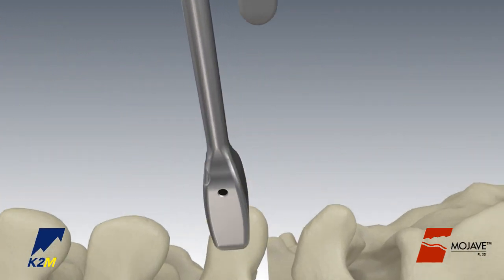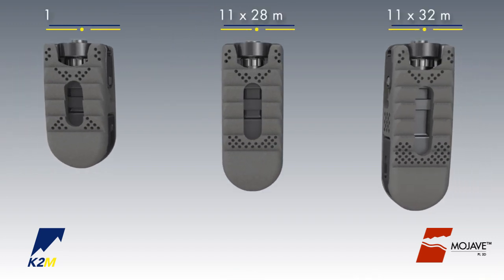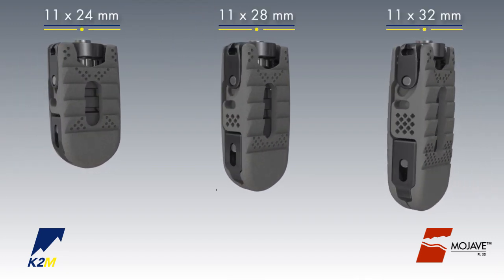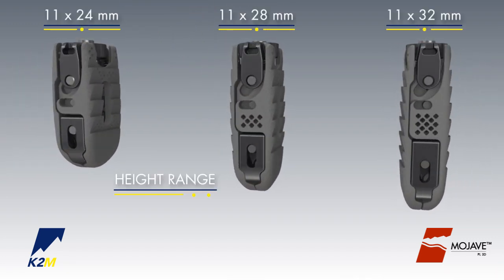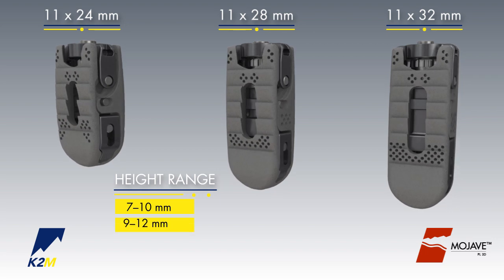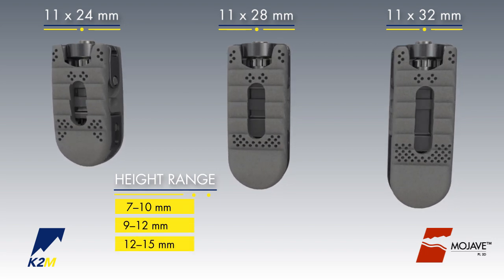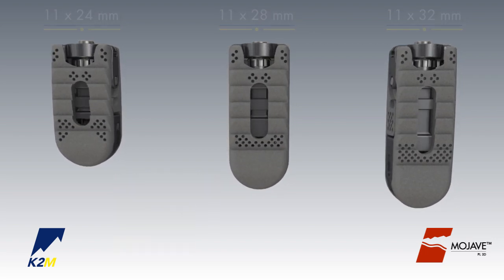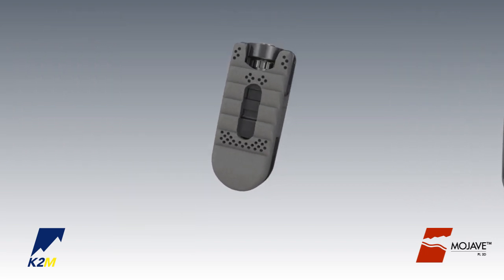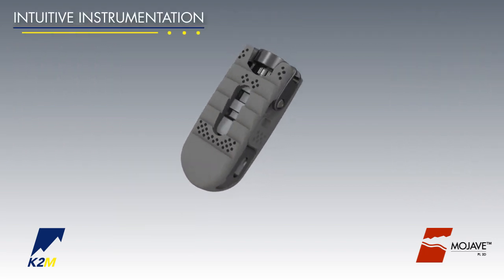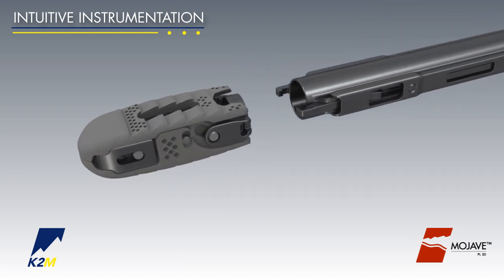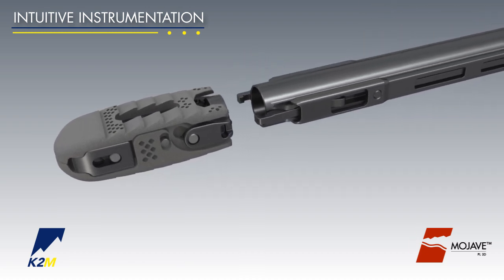Mojave PL3D Expandable Implants are available in three footprints with starting heights offered in 7, 9, and 12 millimeters. The Mojave PL3D Implants can be used in either a modified T-LIF approach or a PLIF approach.